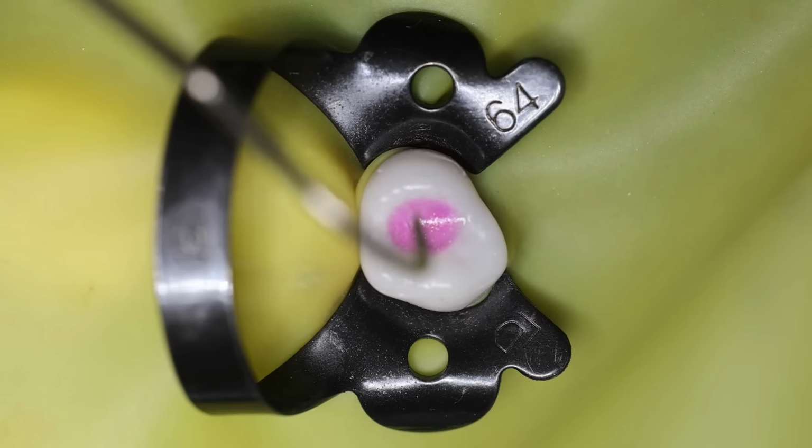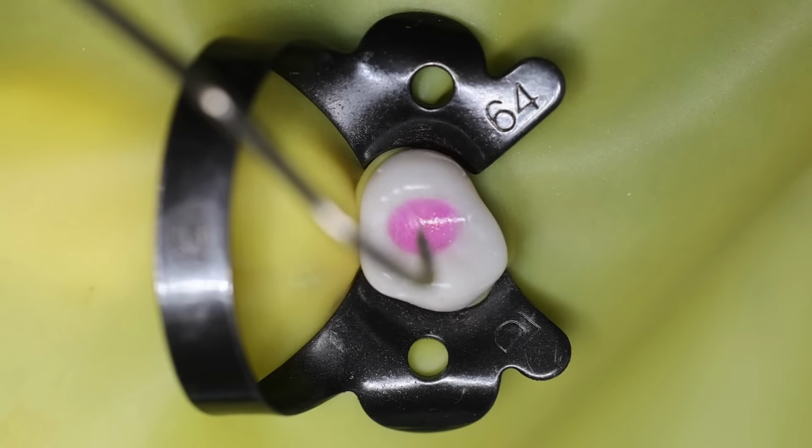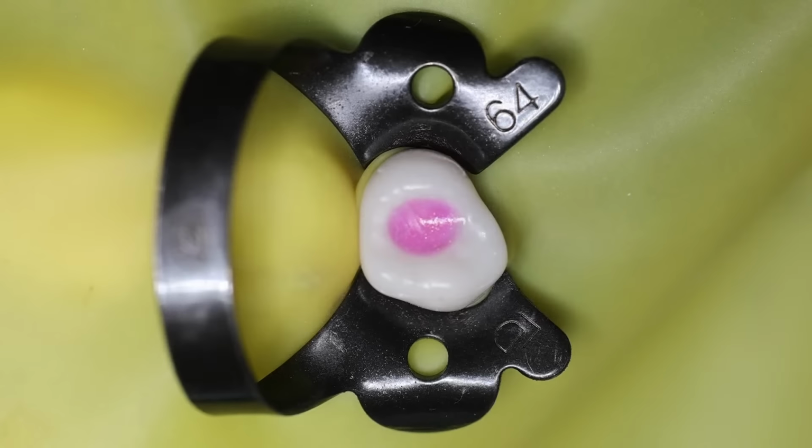In these types of cases we will not go for direct pulp capping, either if there is iatrogenic exposure or traumatic exposure. In both cases we will then proceed with pulpotomy, and in this video we are going to learn about the MTA pulpotomy.